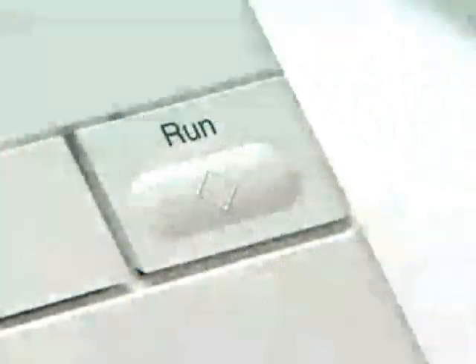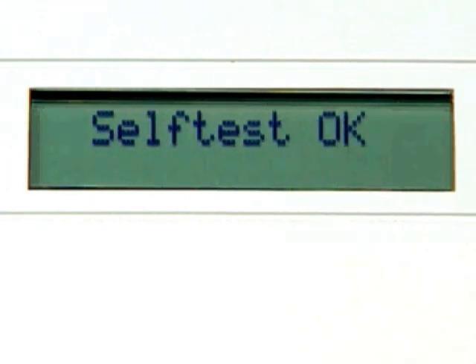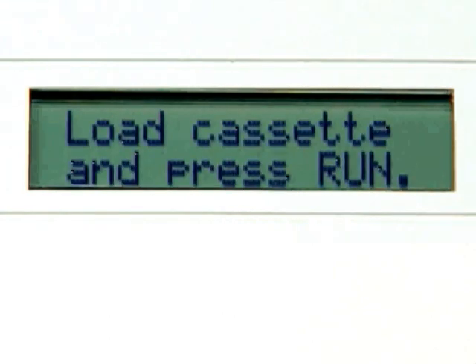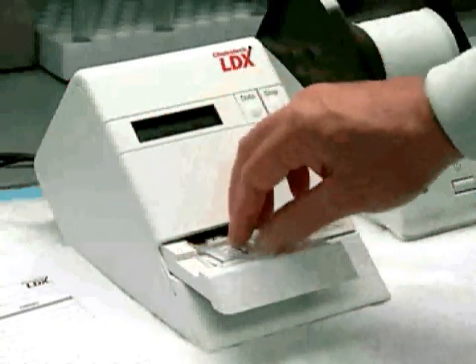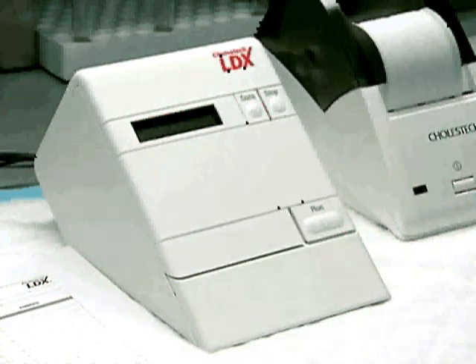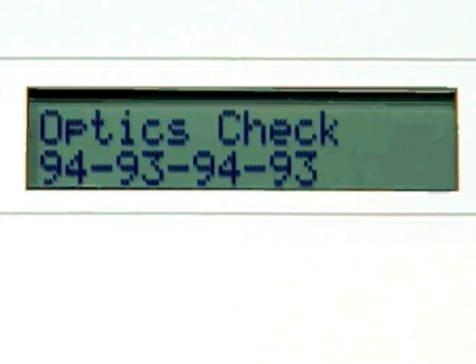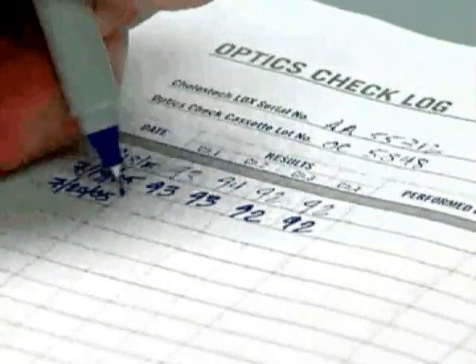To start the Optics Check, press Run and confirm the Self-Test OK message. The cassette drawer will open and you will see the message: Load Cassette and Press Run. Put the Optics Check Cassette into the analyzer. Do not place any blood sample into the Optics Check Cassette. Press the Run button again and the analyzer will automatically perform the Optics Check. Record the Optics Check results in the Optics Check log sheet supplied with the System Procedure Manual.